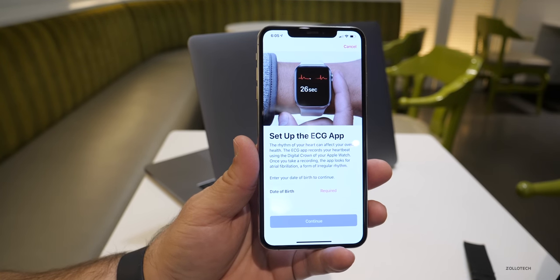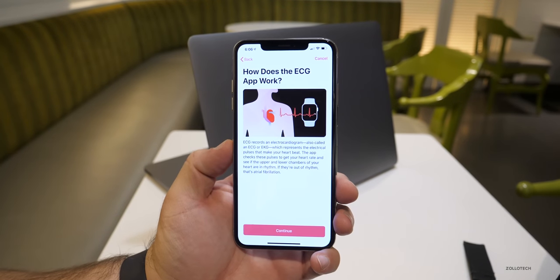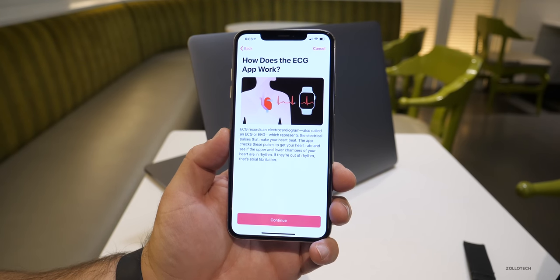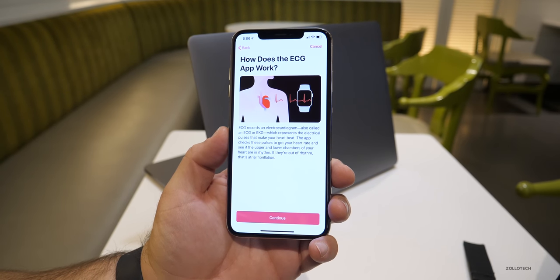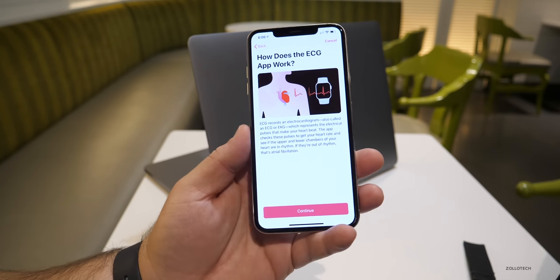In order to do this, you need to be over 22 or it won't allow you to, some people have said. So once I put in my birthday and hit continue, it goes on to explain how the ECG app actually works. It's basically using the pulses from your wrist all the way back to your finger in order for it to work. I'll show you that when we try it out in a moment.